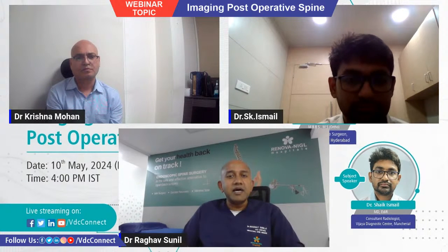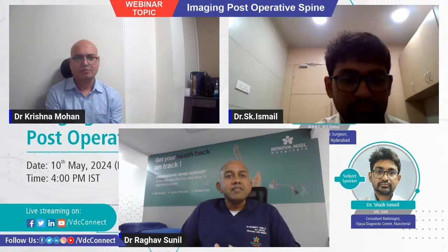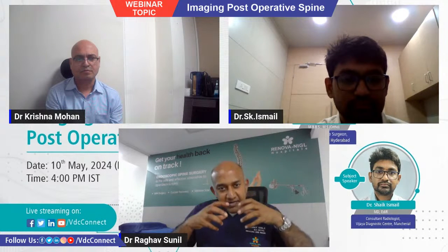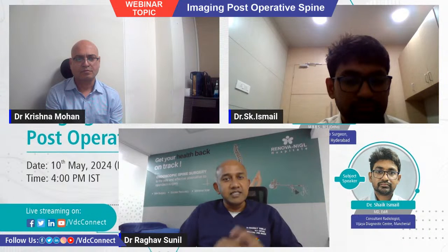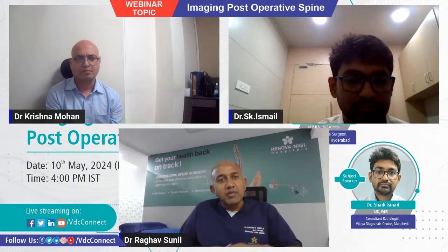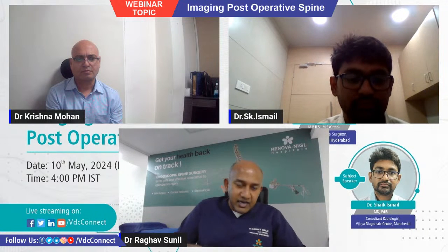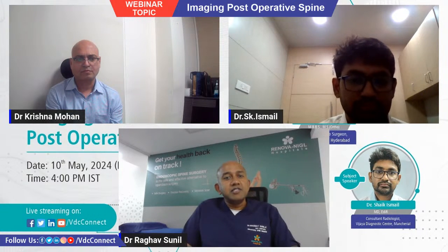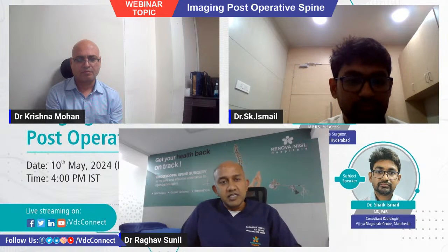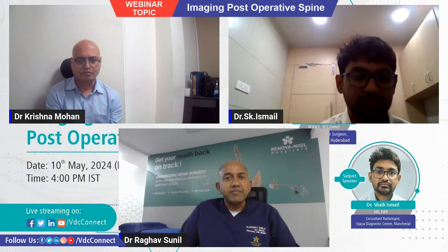Second reason we do an MRI now is to learn exactly what we have done and if there is any room for improvement. Because when we are doing an endoscopic spine surgery, say, we sometimes think that we have decompressed quite a bit, but when we do an MRI, we realize that we probably have or have not decompressed as much as we wanted or more than what we should have. So it will help us fine tune the surgery and help us keep our learning going.